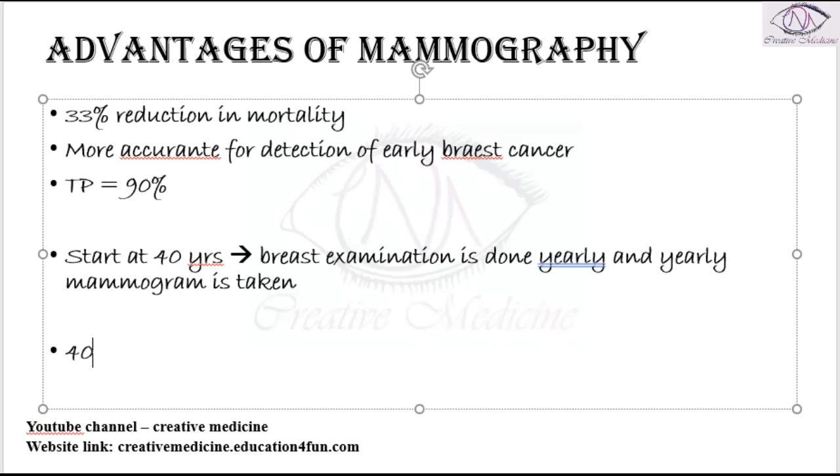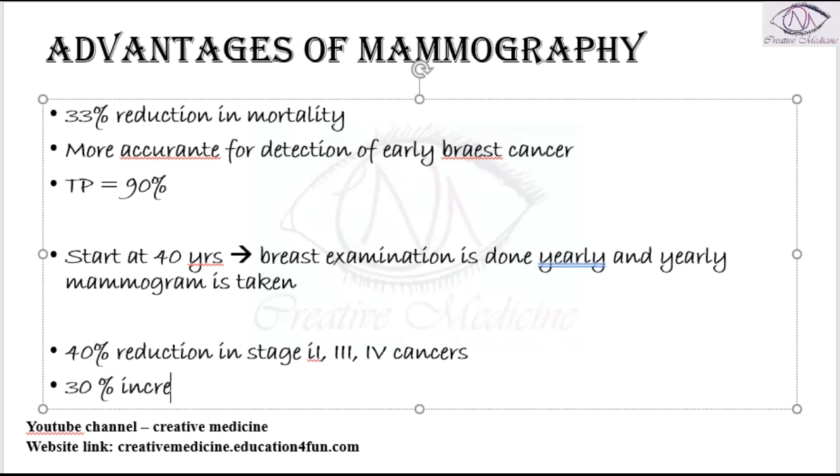Mammography helps in a 40% reduction in stage 2, 3 and stage 4 cancers, and overall it also causes a 30% increase in overall survival.